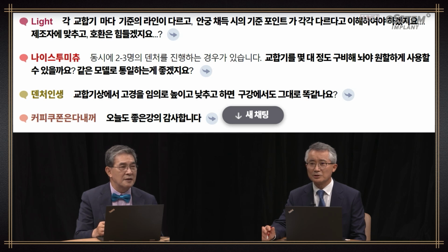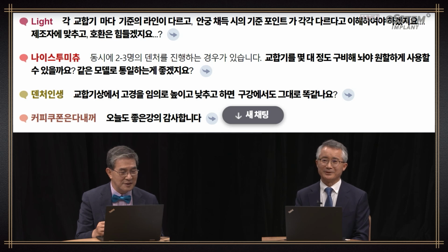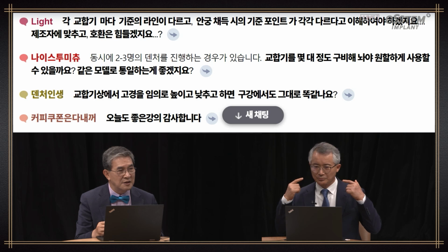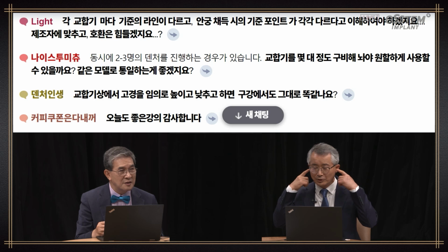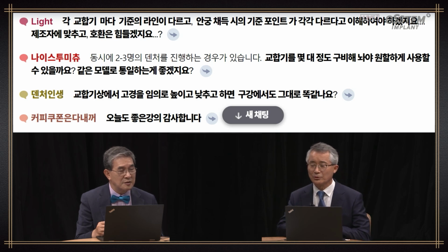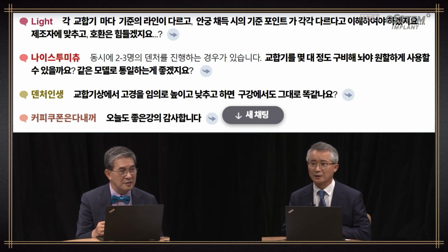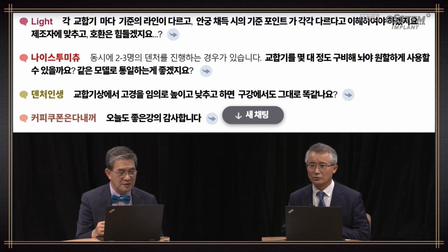In my opinion, I have a similar opinion as you. The reference points that are used mainly are three. There are two at the back earpiece, and there's a vertical point in the front, but many people say that vertical indicators are not important. Perhaps you can use it, but I think it's best to use products from the same manufacturer.